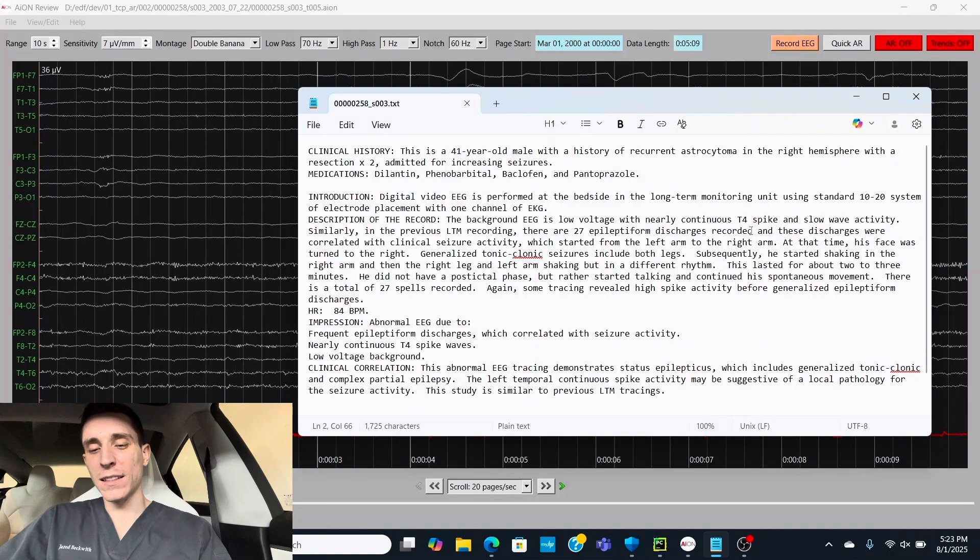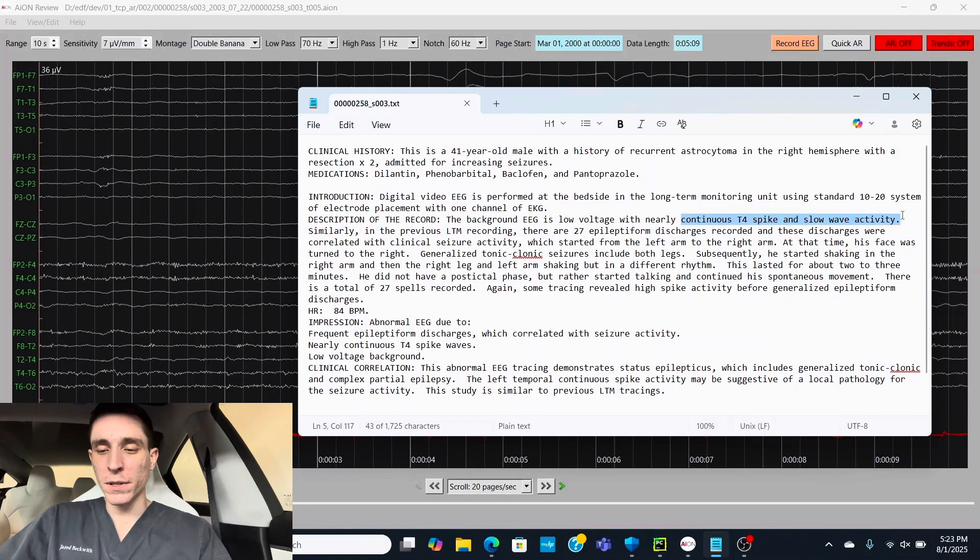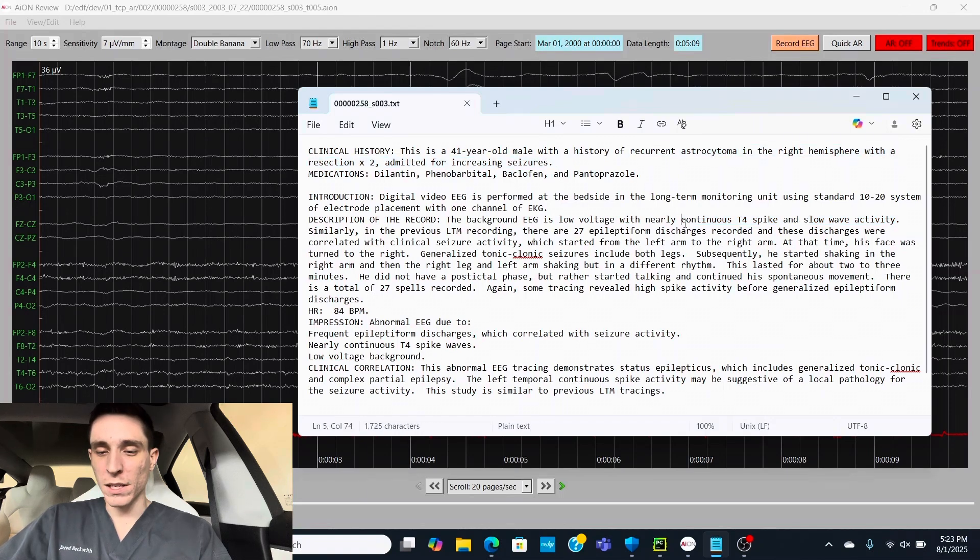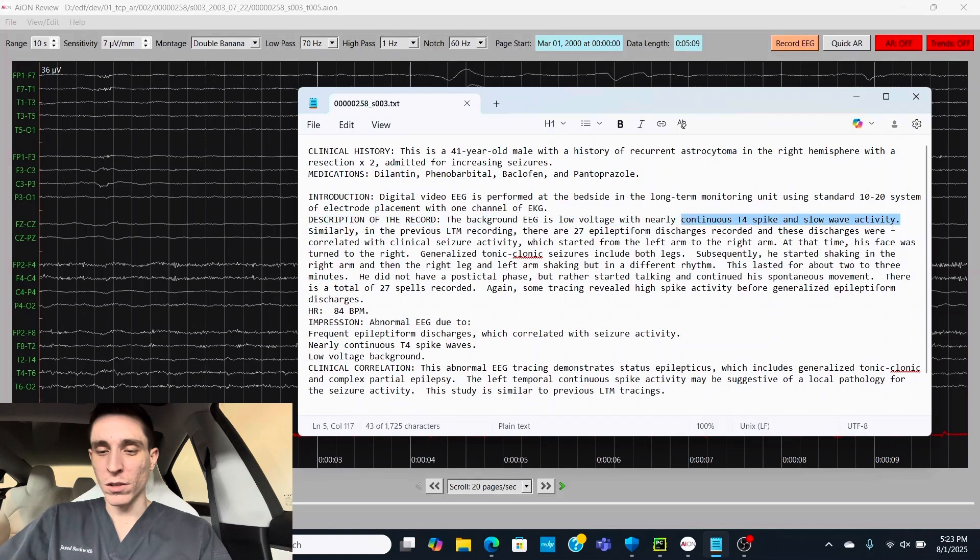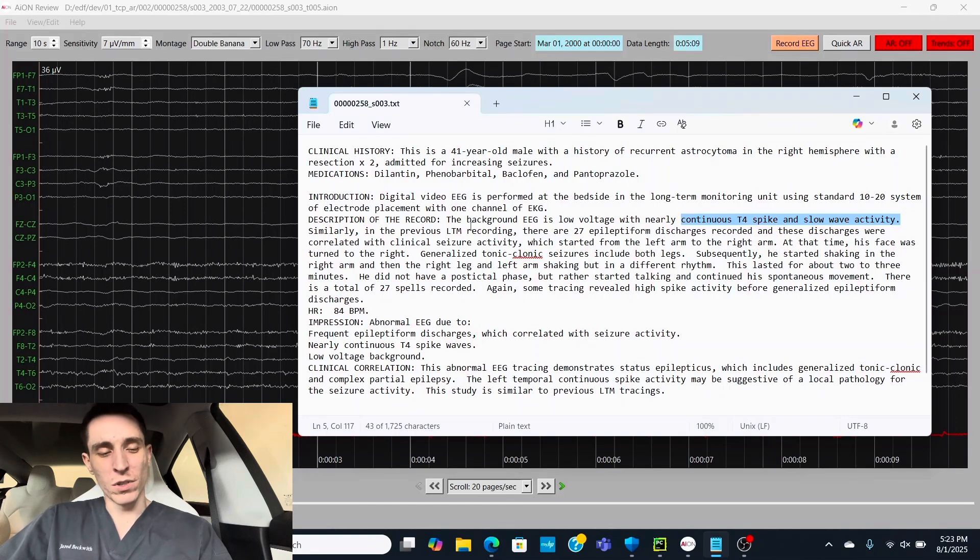And the doctor said nearly continuous T4 spike in slow wave activity. Now what could this be coming from? Well, the obvious answer is the tumor in the right hemisphere lines up with the continuous T4 spike in slow wave activity. Now T4, we're going to want to look around this area when we look through the EEG.